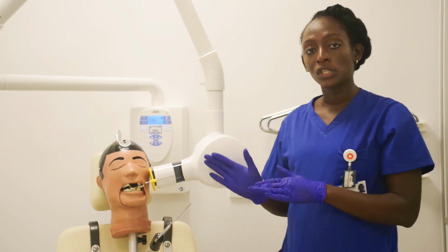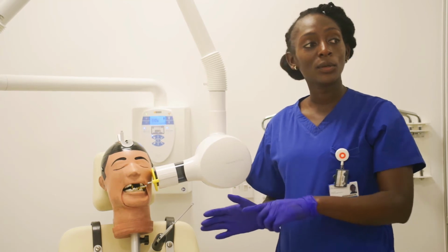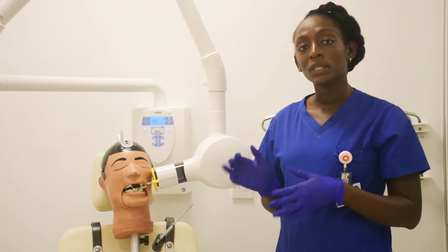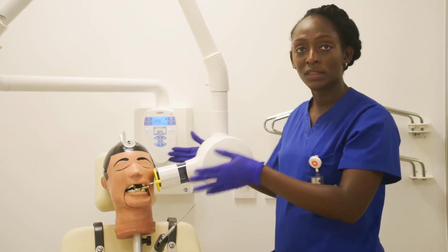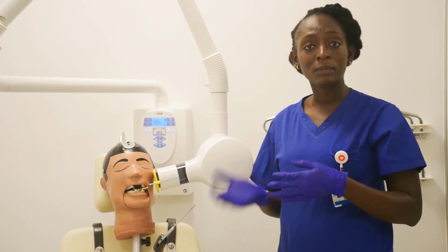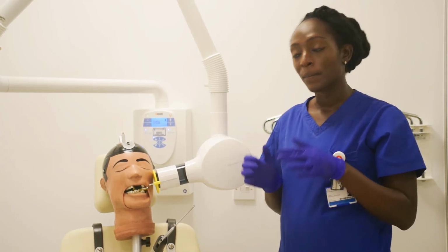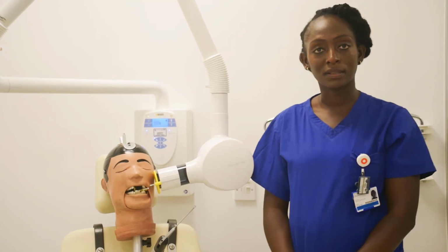So once you've positioned, you tell the patient to keep absolutely still, go behind the screen and press your exposure button. But you need to remember that you don't want to spend the whole time positioning this, because think about it, you've got a holder in the patient's mouth. It's a bit uncomfortable, as you've explained to the patient. So you want to do it as quickly as possible, but try and make sure that everything is aligned, and then press the exposure button at the back.